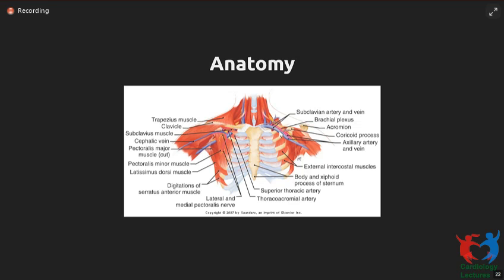And then you have the cephalic vein, which runs in the deltopectoral groove and then joins the axillary vein here. And fluoroscopically, this part of the axillary vein, the place where it crosses the first rib, is exactly where the clavicle crosses. So you see where the clavicle is crossing the first rib, and usually the lower border of the clavicle would be where the vein crosses the first rib. And from there, tracing it laterally, it generally parallels the posterior border of the second rib also. So if you think of this fluoroscopically, you know where the vein is, and you can just puncture even without doing a venogram.